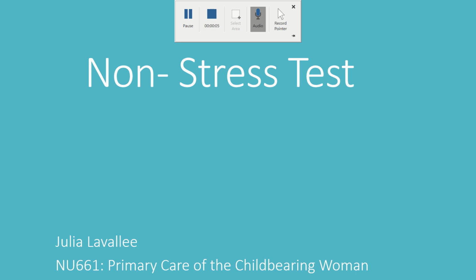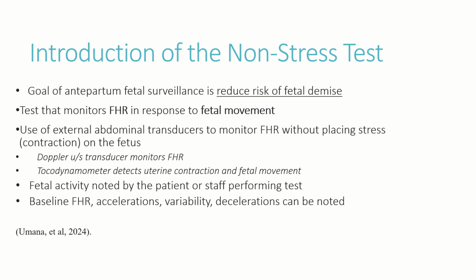The fetal assessment that I chose for this week's assignment was the non-stress test. The overarching goal of antepartum fetal surveillance testing is to reduce the risk of fetal demise. The non-stress test is a test that monitors the fetal heart rate in response to fetal activity or fetal movement.